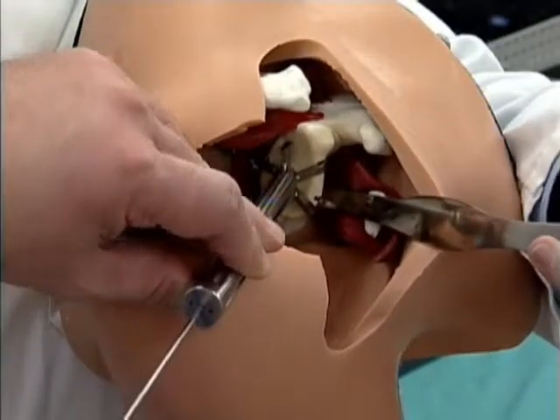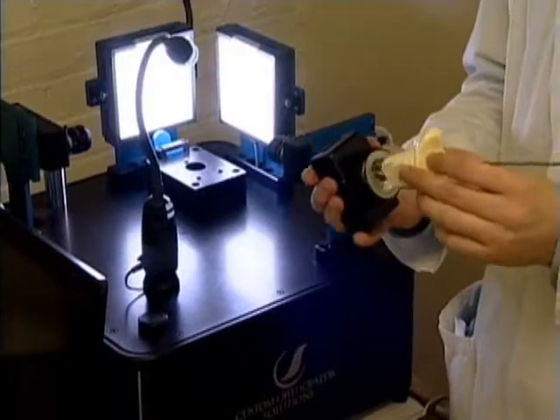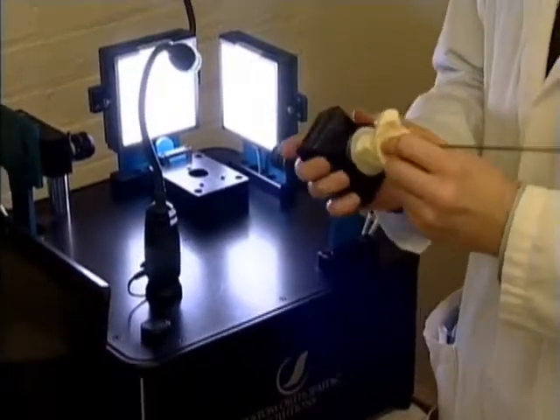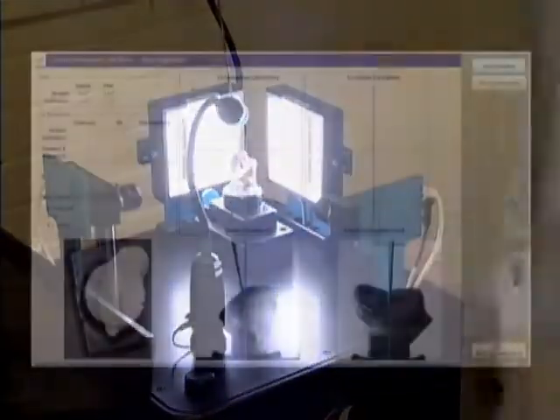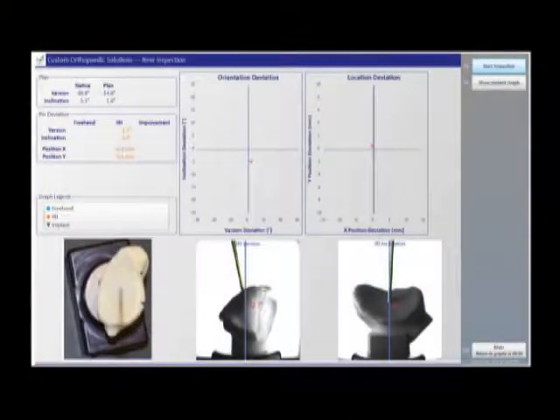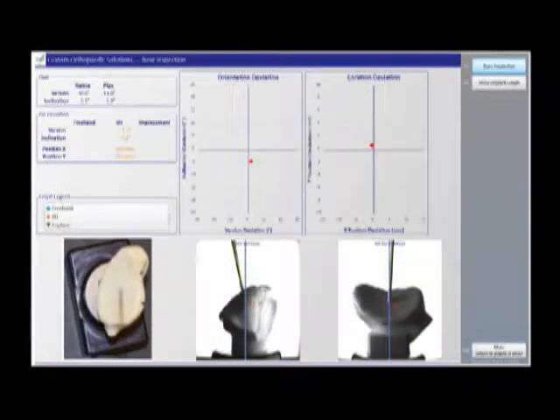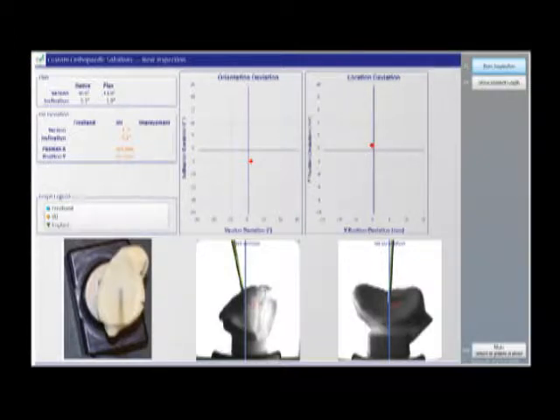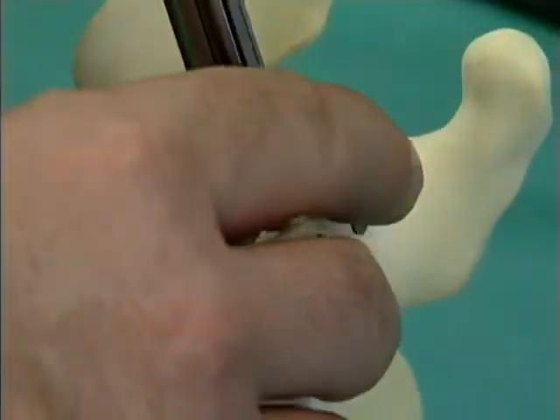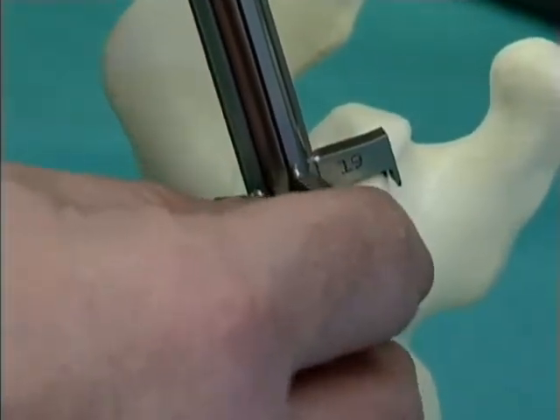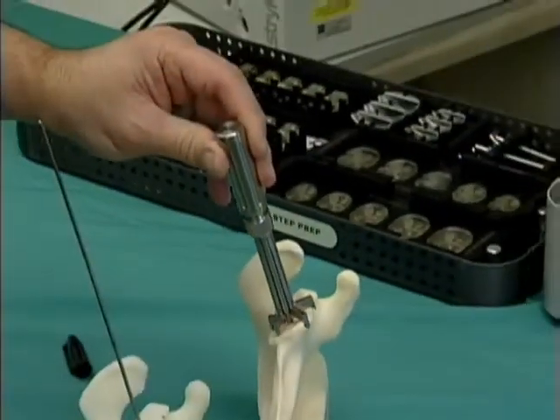This is a simulation model for surgical training. The model that had the guide pin placed is then placed in a measurement tool, which demonstrates the location of the pin as identified by the two dots, demonstrating this to be within 5 degrees of the desired position. As in this particular sawbone model, the guide pin is again placed in much the same way as it was shown in the simulation model.